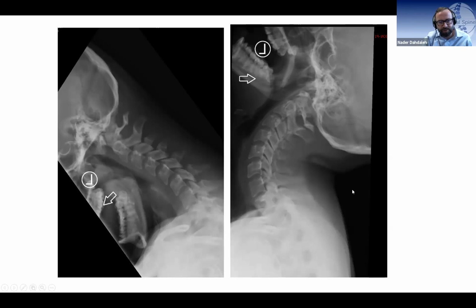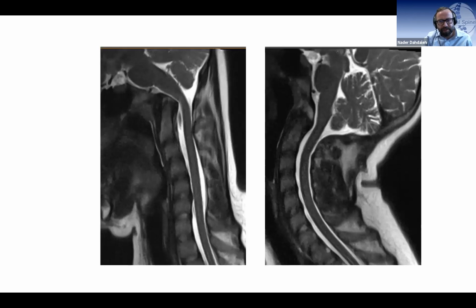But she had certainly symptoms and she has objective findings, you know, ligamentous laxity. So flexion extension MR, you can see here, there's a little bit of stretching of the cervicomedullary junction in flexion, and it's better in extension. Now, you got to counsel these patients a lot, and she's seen multiple opinions from non-surgical treatment to OC fusions. And after extensive counseling, we'd say, okay, well, she has some sort of a C1, C2 instability causing these brainstem related symptoms.